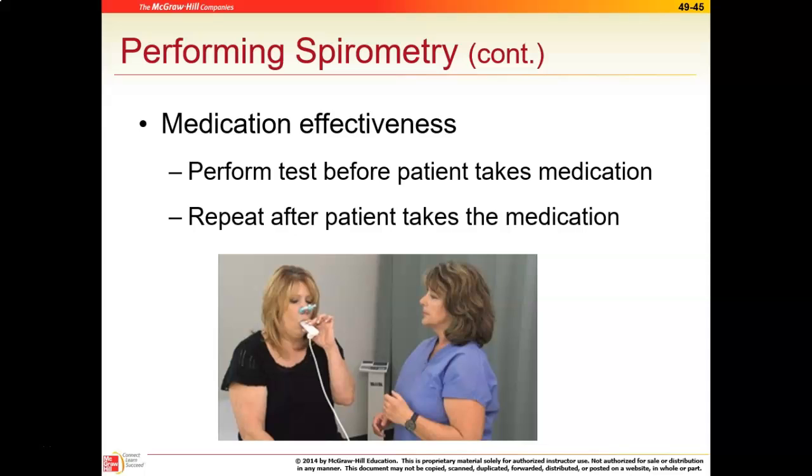Okay. And so once again, you can see this one's a much smaller mouthpiece. She's got her nose clip on. And so oftentimes, they'll do a pre-test and a post-test. The pre-test would be without medication, then they would administer the medication and then repeat the test. And the hope would be that the medication is helping that person and their volumes would increase with that medication.